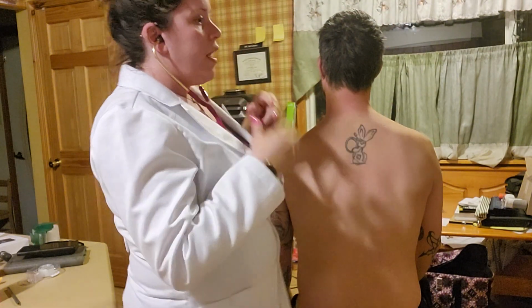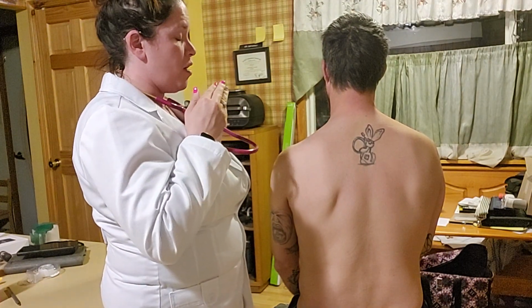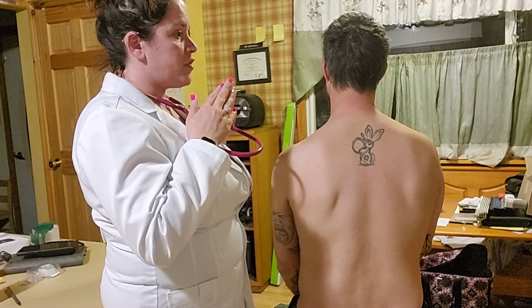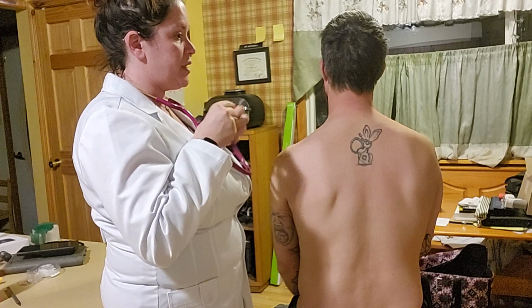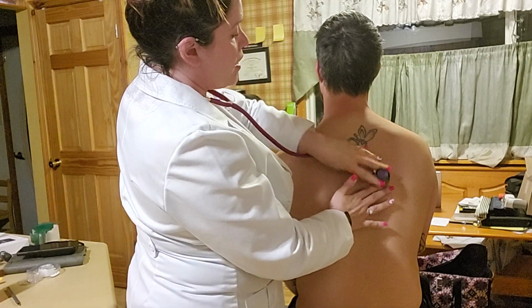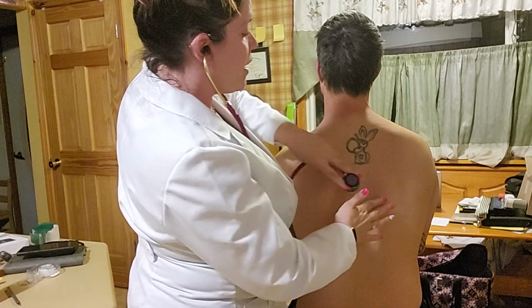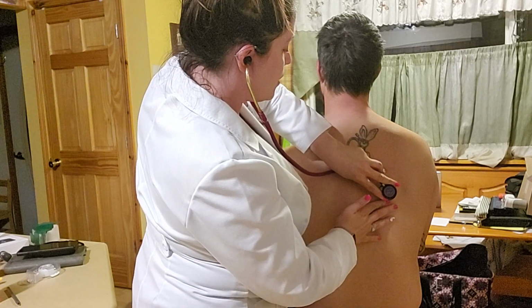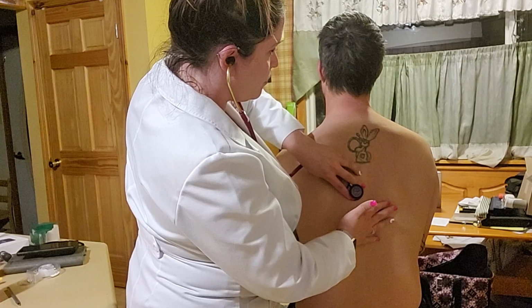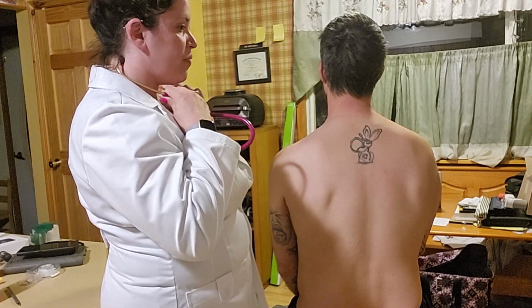Okay, and now I will test the patient for the voice transmission test. So I'm going to place the diaphragm of my stethoscope on the patient's back, on the posterior, and have the patient say E, E, E 3 times when you feel my diaphragm touch your skin. E, E, E. Okay, and that is testing for egophony.